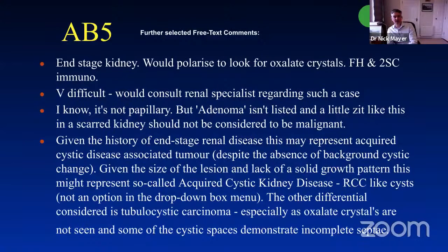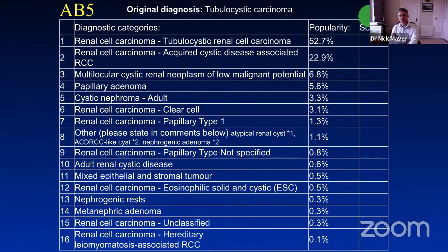So summarizing all that, it's a very difficult, complex case, and unsurprisingly, we didn't hit the threshold of 70% agreement, which really makes it a kind of unscorable, but certainly a case of interest.